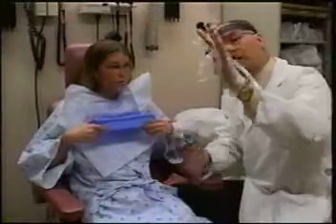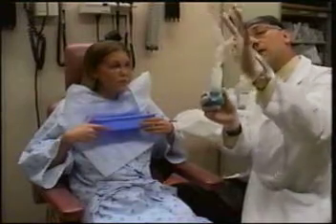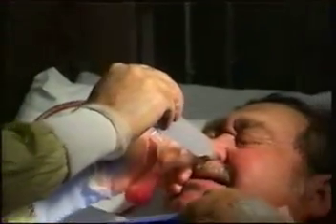It can be used to clean post-operatively in functional endoscopic sinus surgery by atraumatically removing the debris that can otherwise, oftentimes, lead to post-operative secondary infections. X-rays on the left show ethiodyl-filled sinuses by displacement maneuver. X-rays on the right are post-aspiration irrigation maneuver. Notice the nearly complete emptying of sphenoid sinuses and 60% clearing of ethmoid and maxillary sinuses.